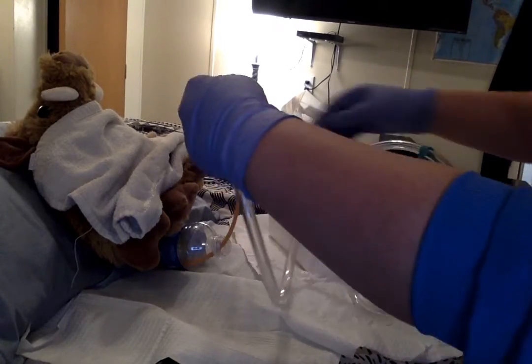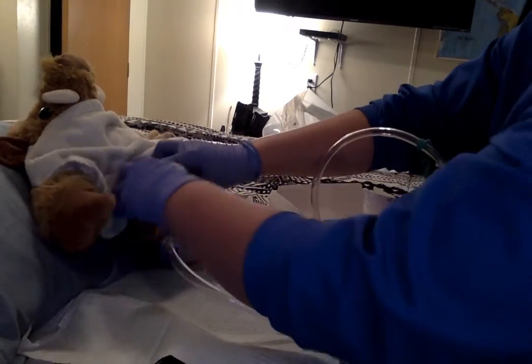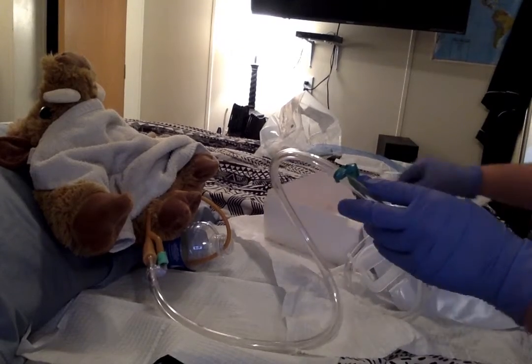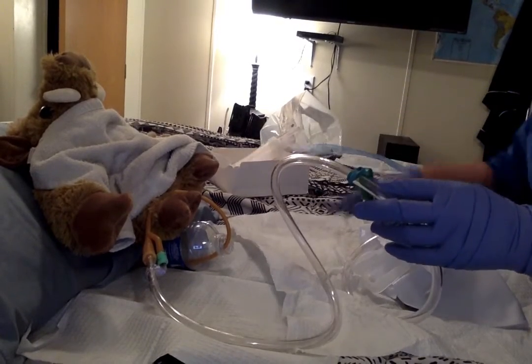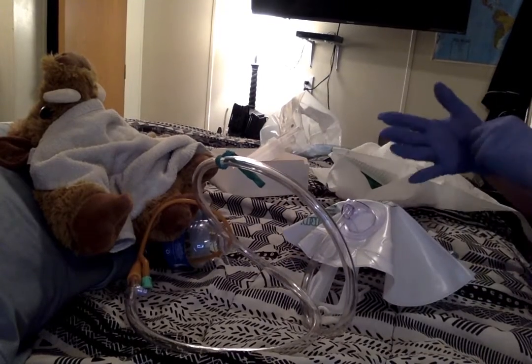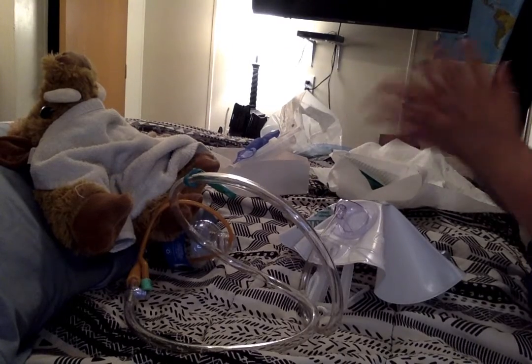We can take this out of the box. We're going to drape this across the patient's leg, and we're going to apply a Foley anchor to the patient. Next thing we're going to do is, at this time, we're going to take off our dirty gloves. We are going to perform our hand hygiene.